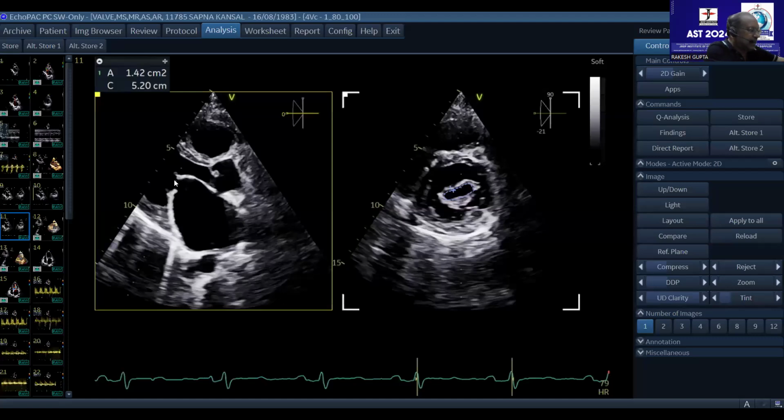That's how it works. Just write it down on a piece of paper, go back tomorrow, go to the parasternal short axis view at the aorta, and then tilt your footprint from the aorta to papillary muscles, means from the right shoulder towards your left hip. As you tilt from the right shoulder towards your left hip, the first thing after the aorta will be the mitral valve leaflet, then the papillary muscles, and then the LV apex.